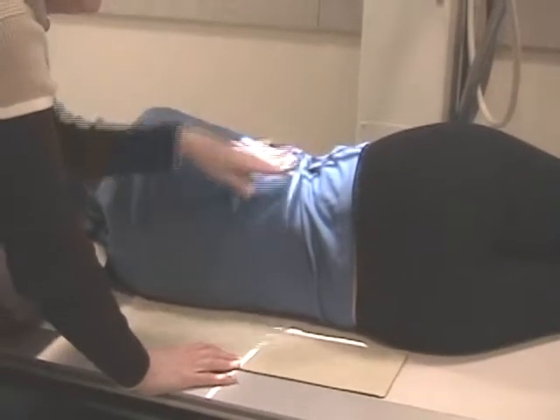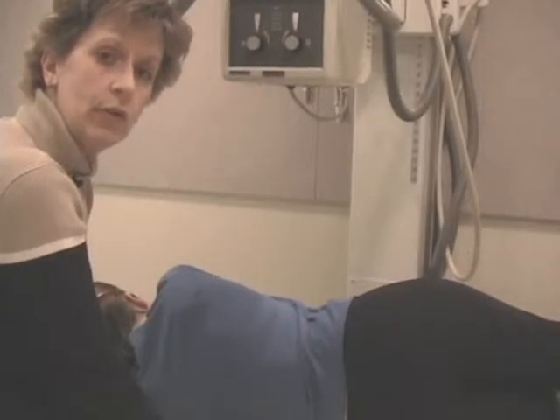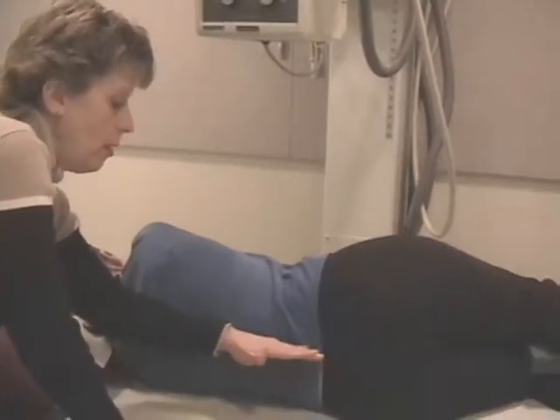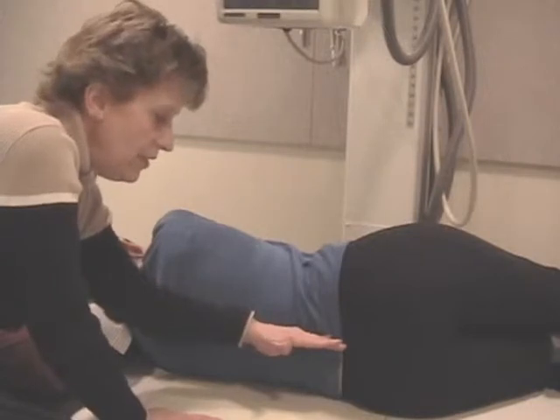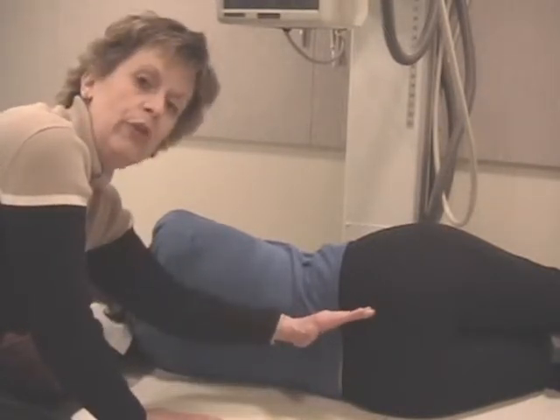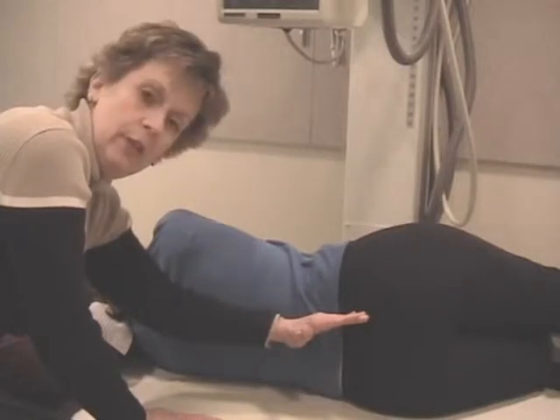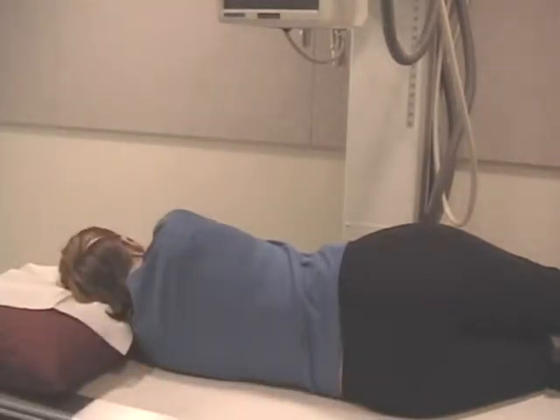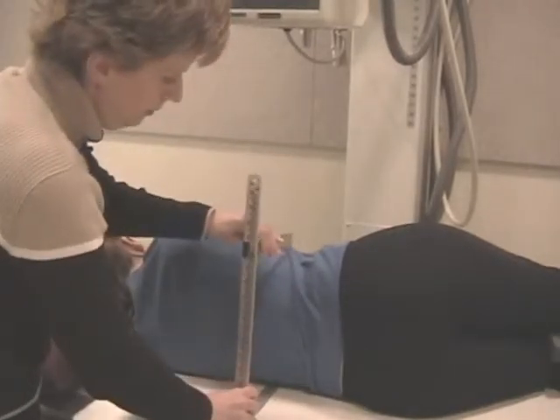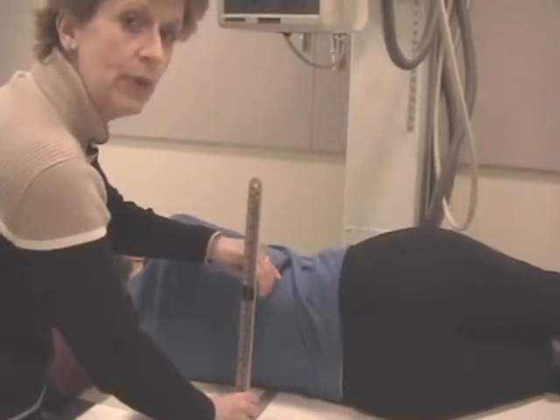Okay. So again, just to recap, patient is straight on the table in a true lateral position. The mid-axillary line is to the center of the film, and the center of the film is 2 inches above the iliac crest. My patient's spine was almost perfectly parallel to the film, so I left the tube in a perpendicular relationship. If the spine had angled, I would have put probably a 5 to 8 degree caudal tube angle on this particular patient. But since the spine was parallel, I did not. Again, you would measure the patient, have her take in a breath, blow it out. Then you would measure where the central ray goes, set your panel, make your exposure.